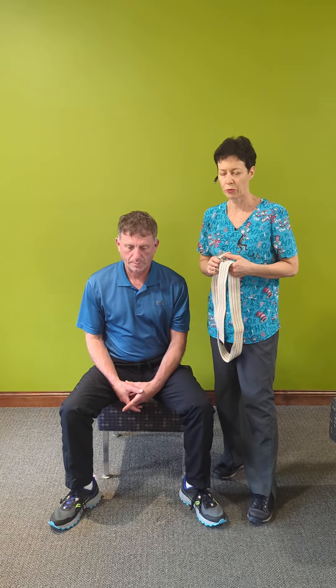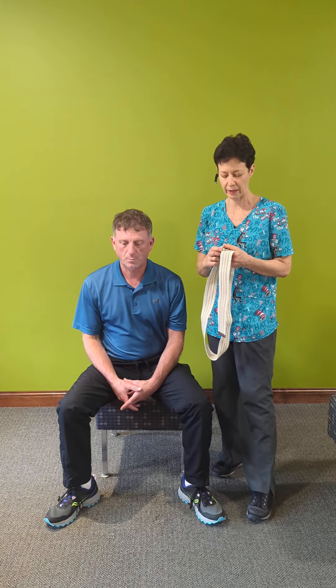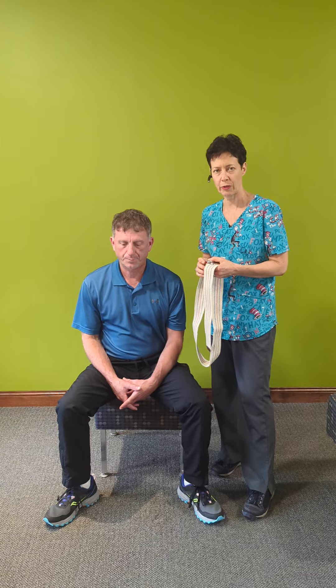In this video, I want to talk about a really important safety tool that you can use at home if you find yourself in the same life stage as many of us, where you're becoming a caregiver to someone in your life or someone who works as a caregiver. It's called a transfer belt. You can find them online for $10 or $15. It's a very simple mechanism that allows you to have better control of the patient when you transfer them.